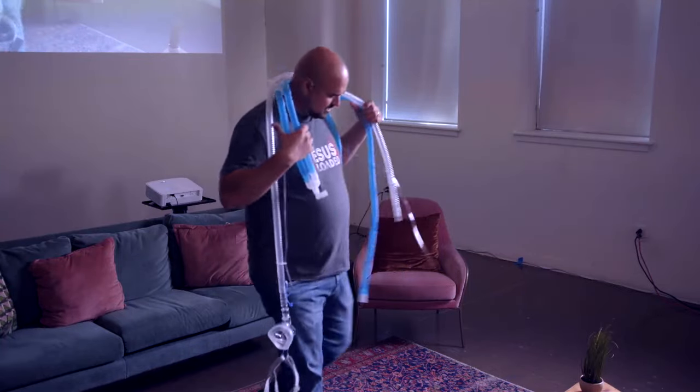You have a patient on non-invasive ventilation and you need to make sure we're allowing them to exhale. This has become a bigger deal post-pandemic because we have different types of equipment that, if used together, can harm your patients.